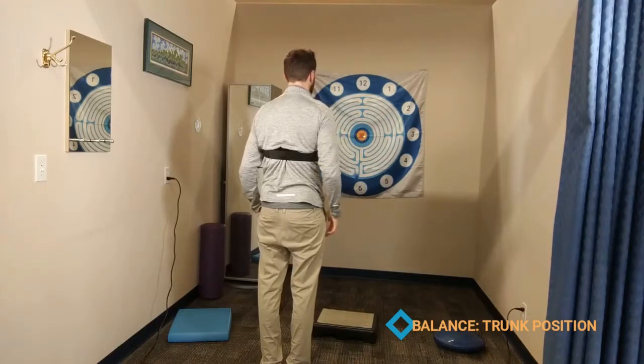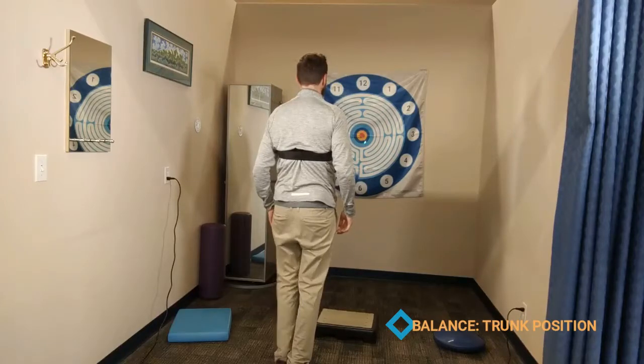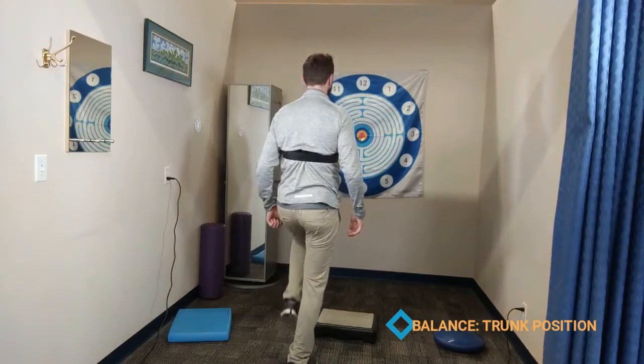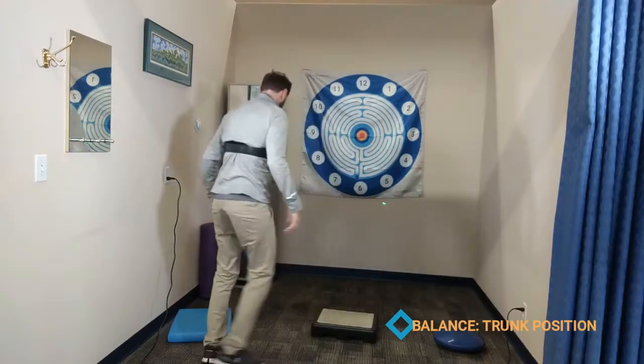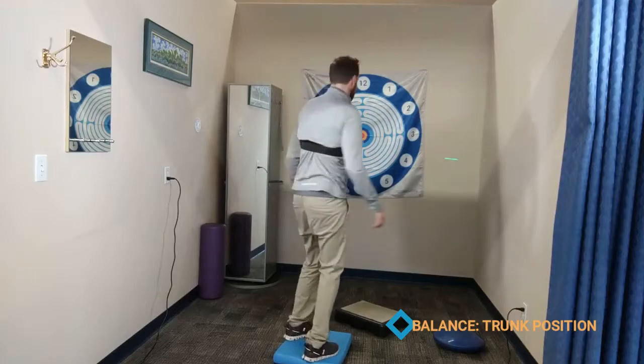You can then perform your balance progressions from narrow stance, tandem stance, single leg stance, and also things like standing on foam and other uneven surfaces.